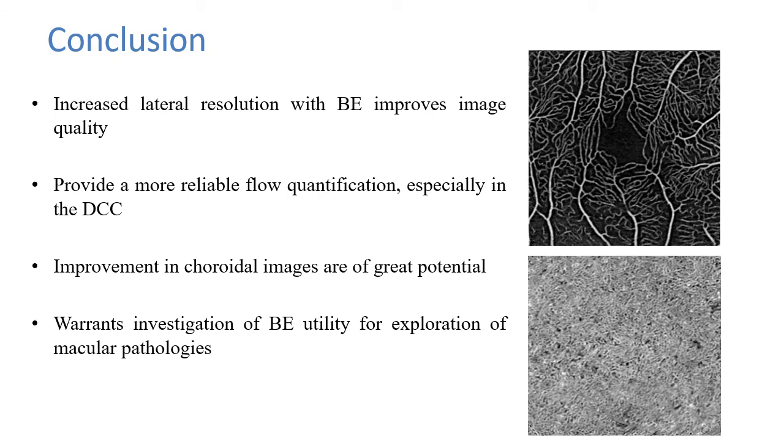In conclusion, the increased lateral resolution with beam expander improves the image quality, as you can see again here, and provides a more reliable flow quantification, especially in the deep capillary complex where there is usually more artifact and the resolution is more critical. There are improved choroidal images, as you can see here, which is of great potential. So all these data warrant investigation of the beam expander utility for exploration of macular pathologies now.